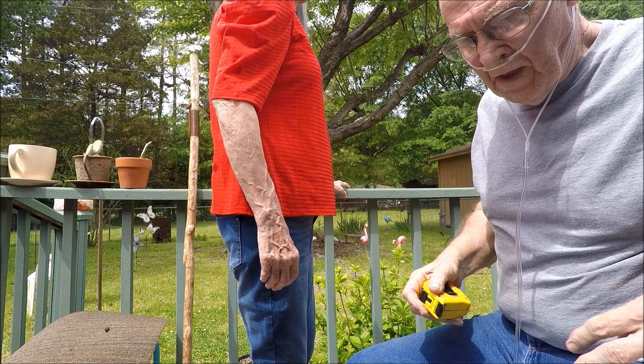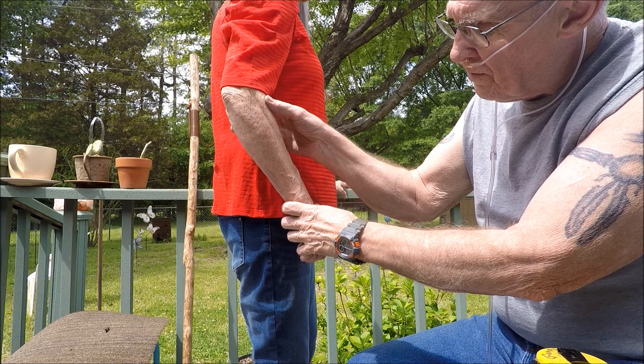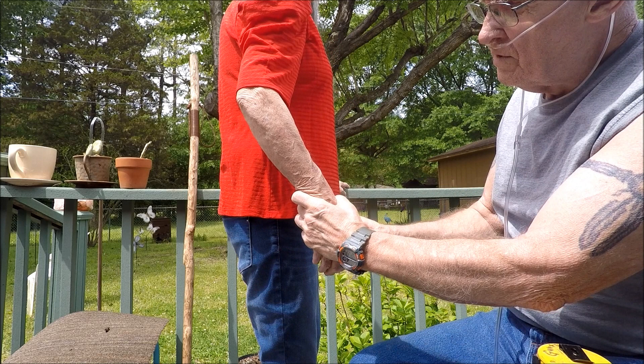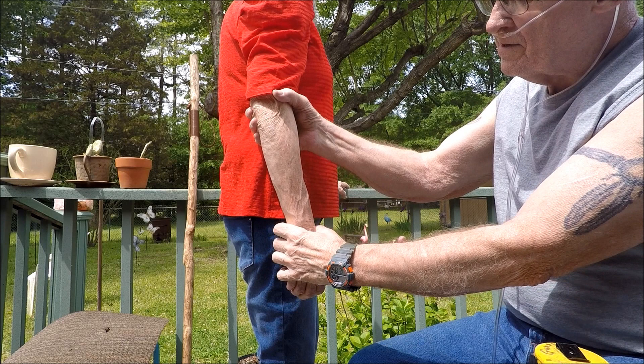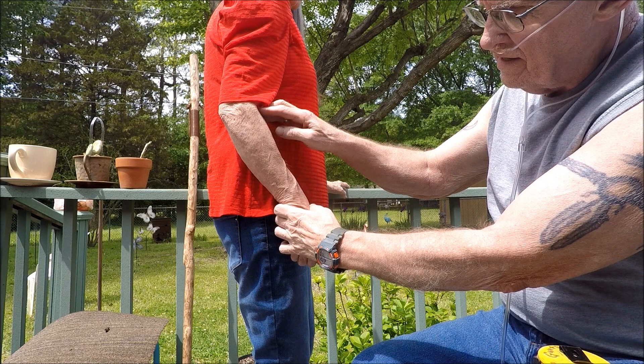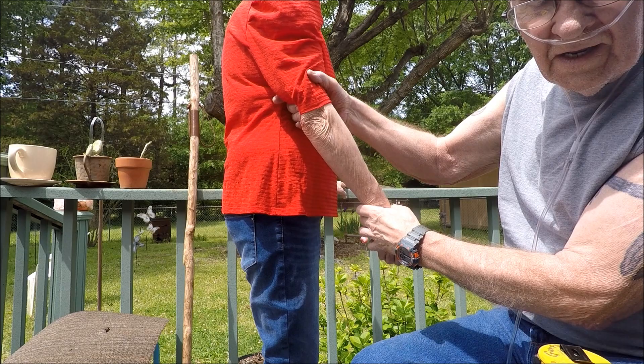The reason you want a slight bend in the elbow is that when you reach out with the cane and put it down, your arm goes straight. When you come back, it moves up slightly, and when you go forward again your arm straightens. If your arm were straight at rest and you reached out, you wouldn't be able to touch the ground in front of you. With a slight elbow bend, when you reach out and pull back, your arm goes straight each time.